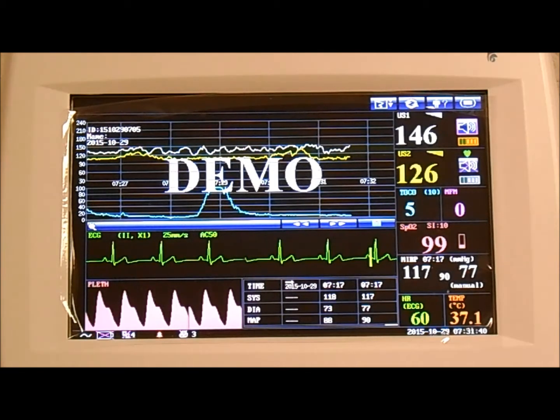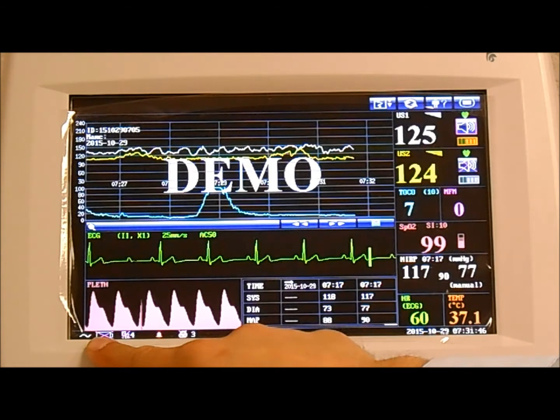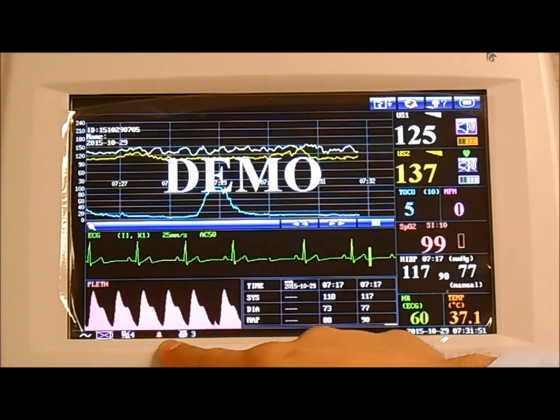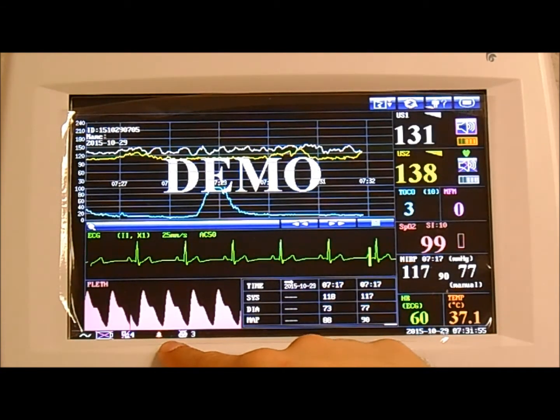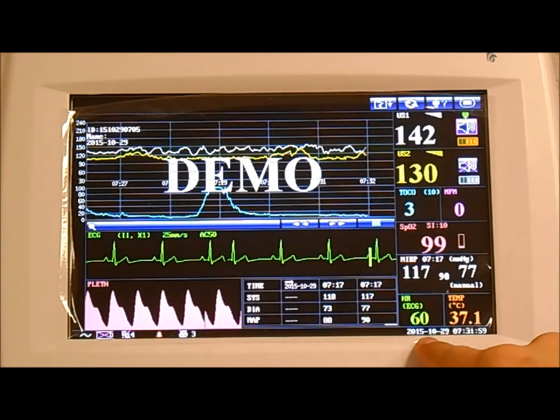Now let's review the different sections on the screen of the monitor itself. In the lower left hand corner we have the AC power icon. Next we have the battery, the alarm. If it has an X over it, it means that it's silenced. Next we have the printer icon, time and date.